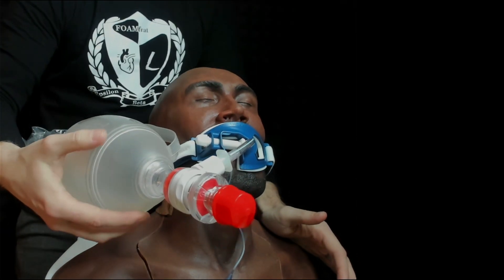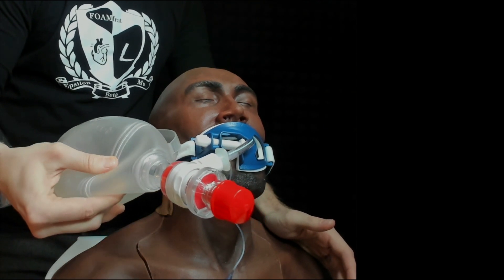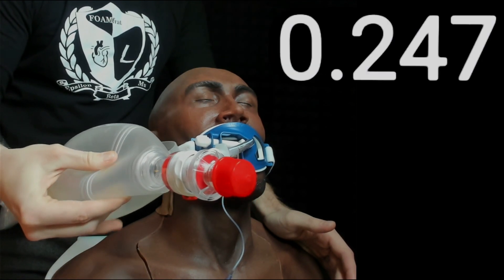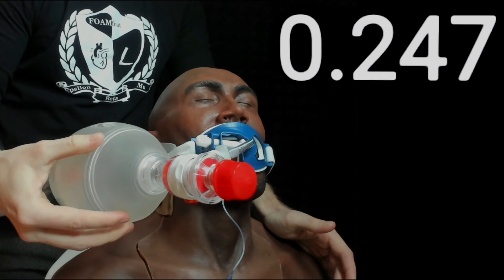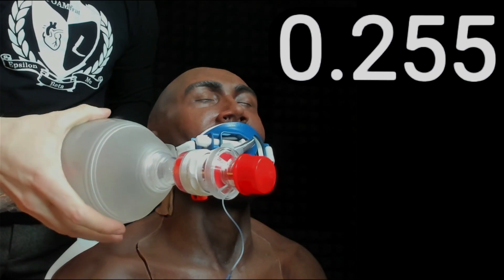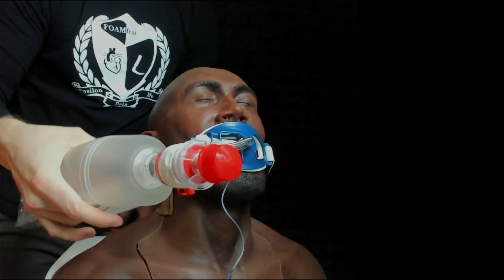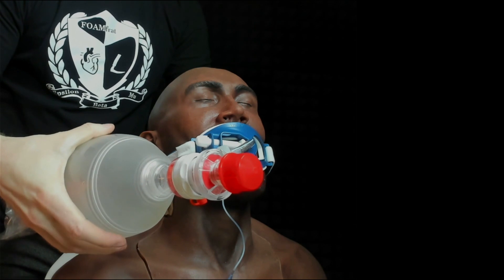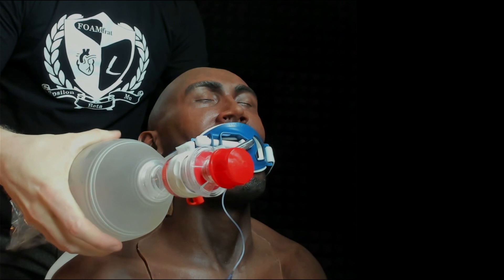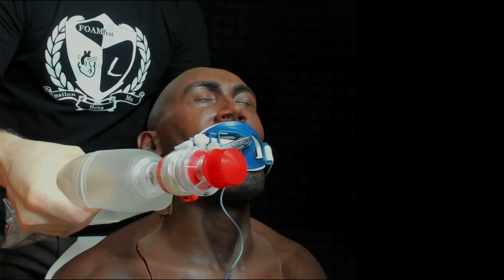I'm going to start squeezing right here on the corner along the front seam — see if you can guess that tidal volume. Now I'm going to move to essentially having my middle finger and thumb touch right in the middle of the bag valve mask. The total volume of this bag is again 1,400, so let's see what squeezing right here in the middle gives us.